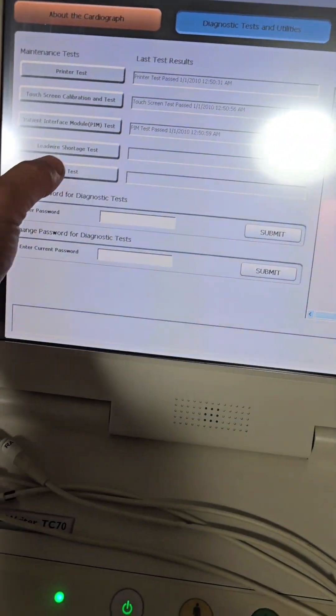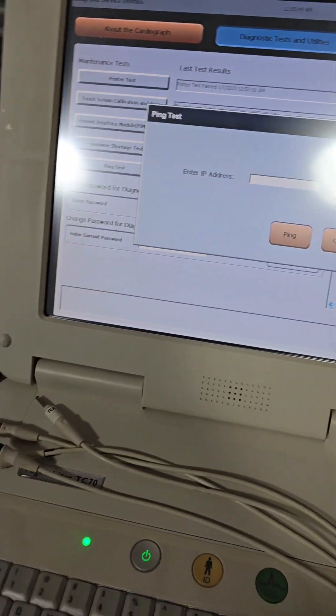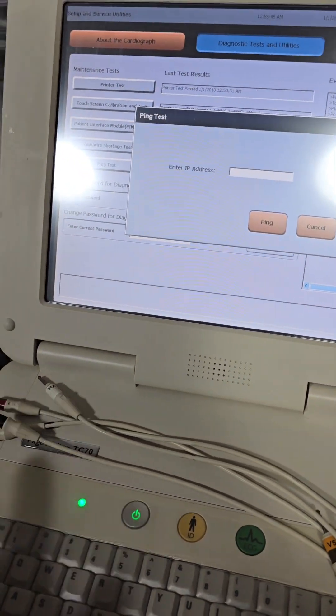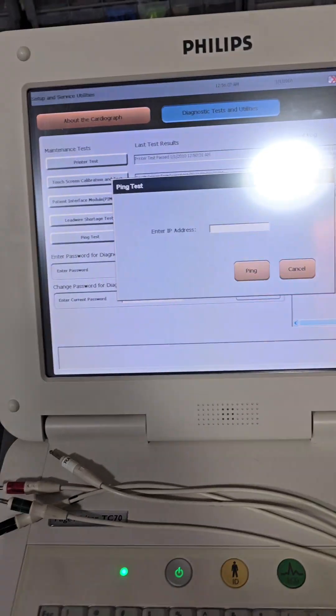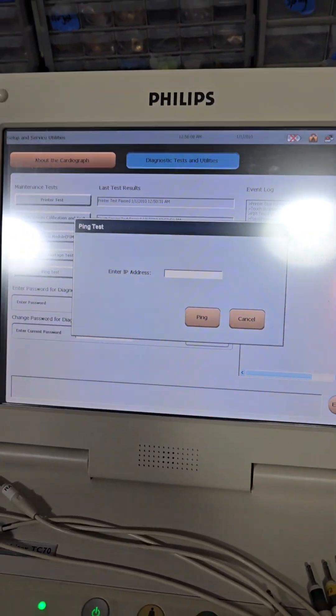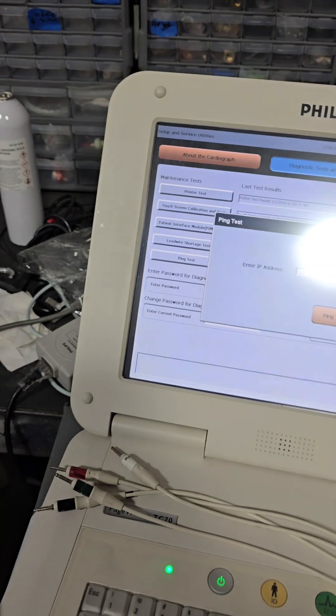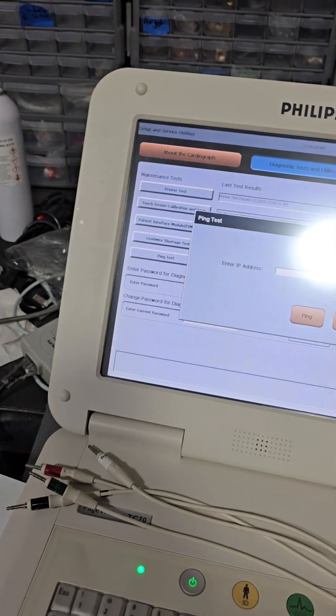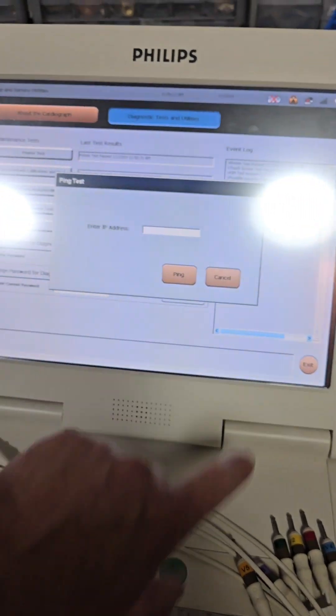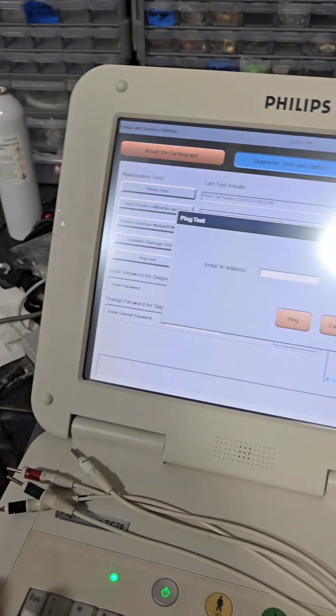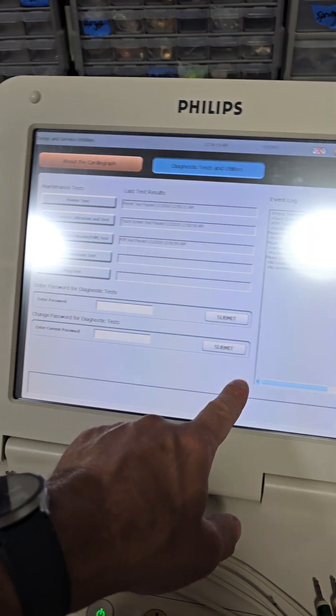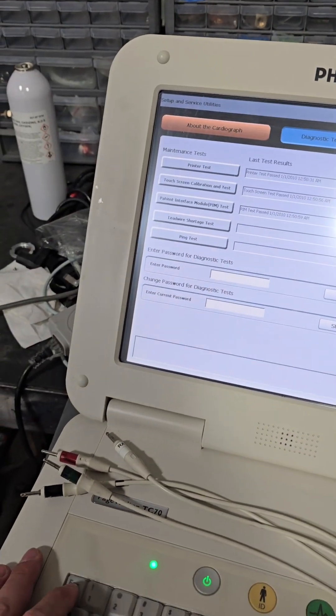Alright, looking better now. Ping test. IP address. I have to be connected to a network or something for this. I don't have one. So, skipping this test. That's it.